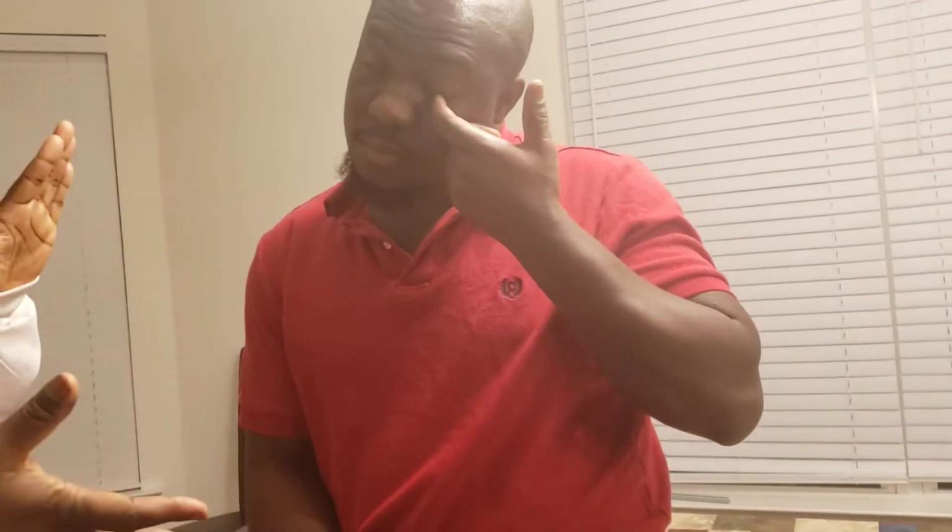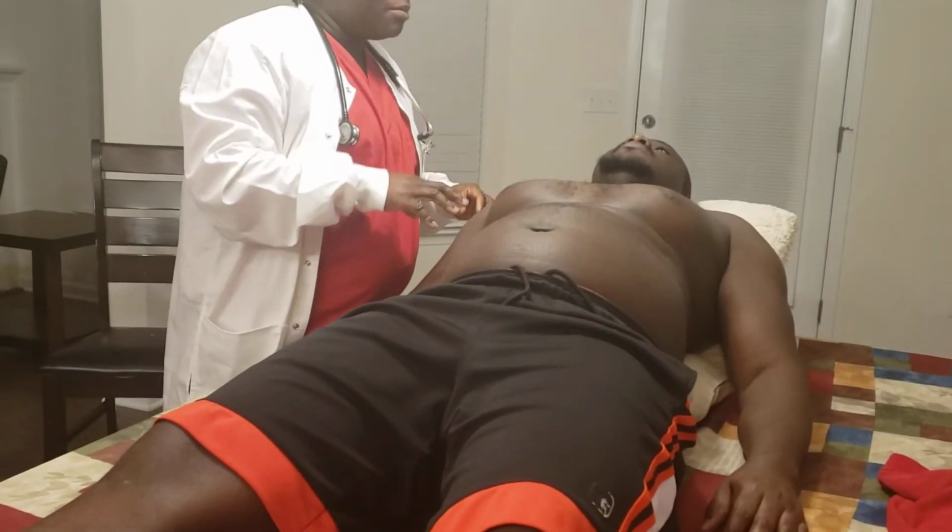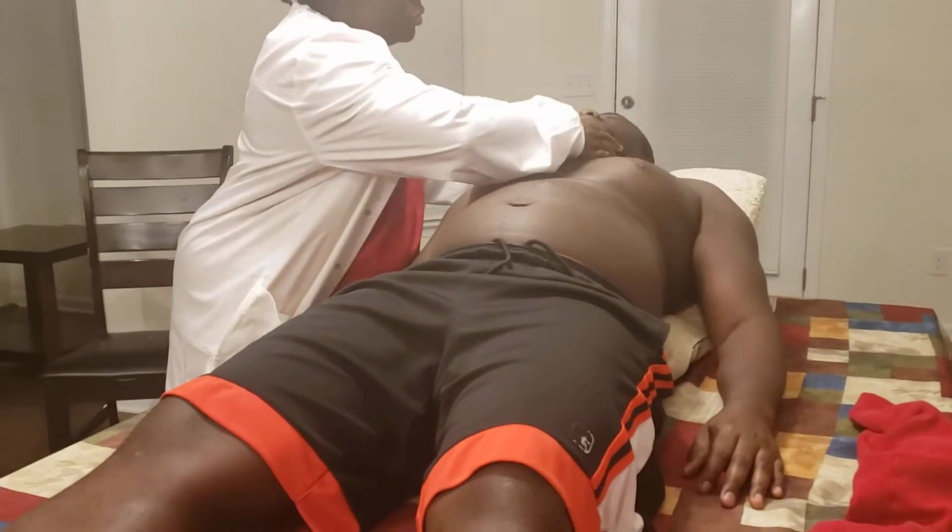Your lungs sound very clear, both anteriorly and posteriorly on all the lobes as I auscultate. That's very good. I would need you to lie down for me. So I'm going to get you some pillows to elevate your neck to a 35-degree angle, so we can do the rest of the assessment. Okay. I'm going to check your jugular vein. So turn to this side for me. Come closer.